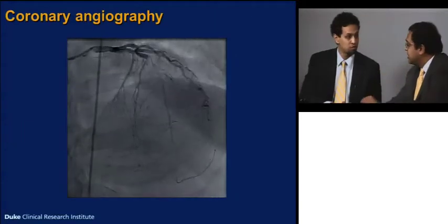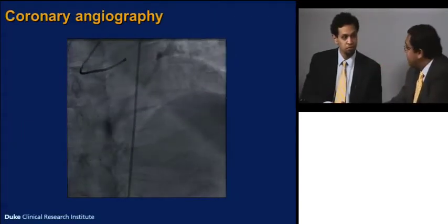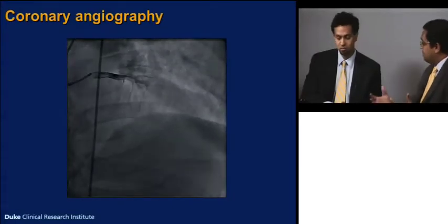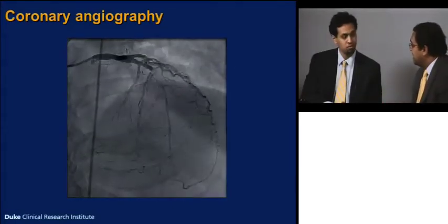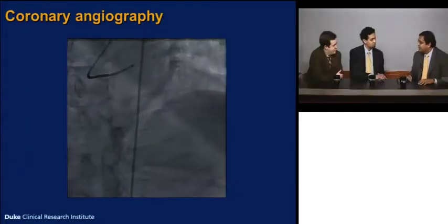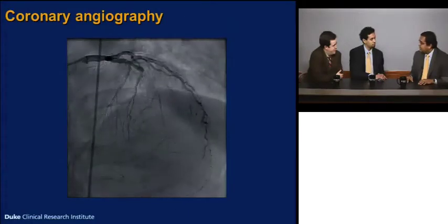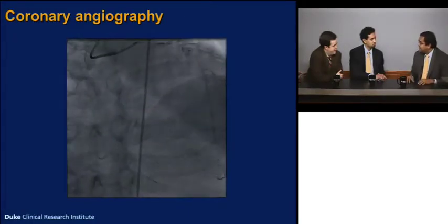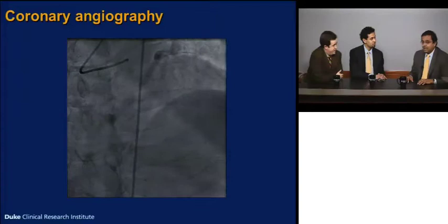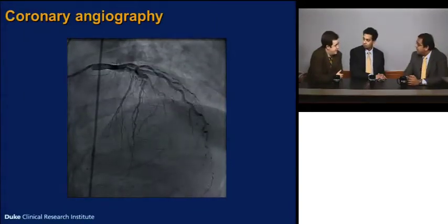Before we look at this angiogram, Adrian, I note on that guideline it's 2A, but it's level of evidence C. It's consensus. It's opinion. The guideline committee had the opinion that they should go to cath if they have chest pain. I'm not saying it's the wrong opinion. I think it's probably the right one. But how is it that we got this far in heart failure care and we don't have any studies telling us whether or not they need a heart cath in a pretty common situation? Yeah, so that's kind of a sad state of affairs, isn't it?